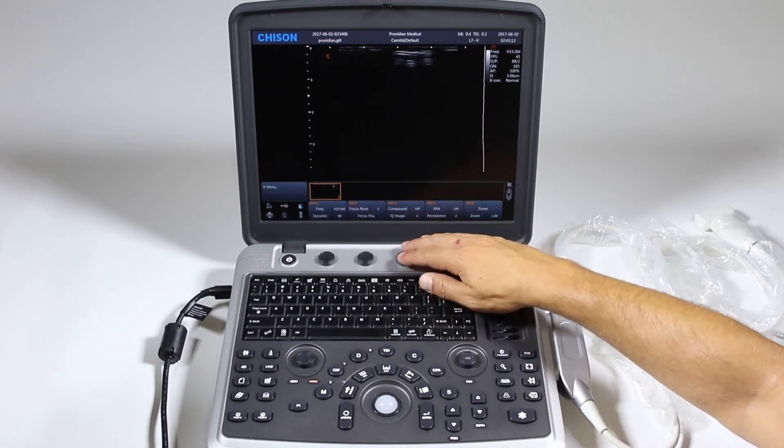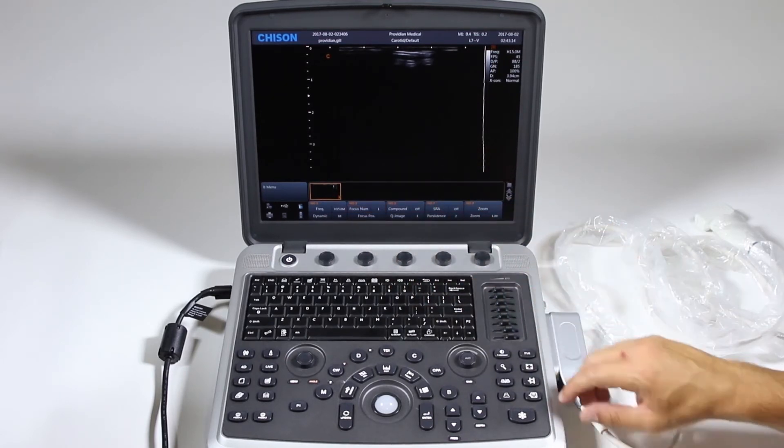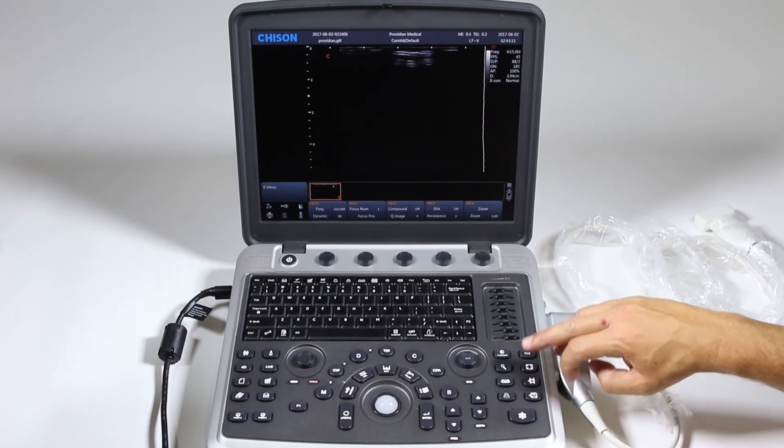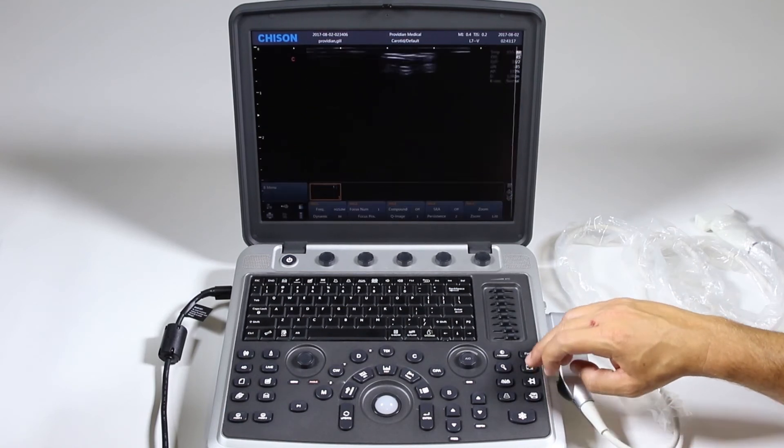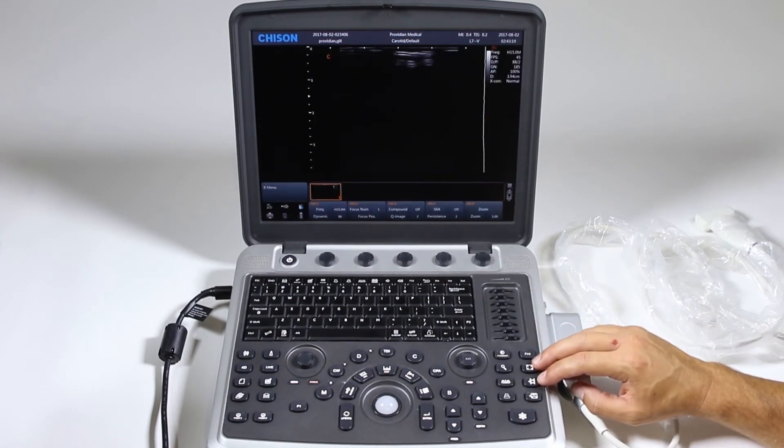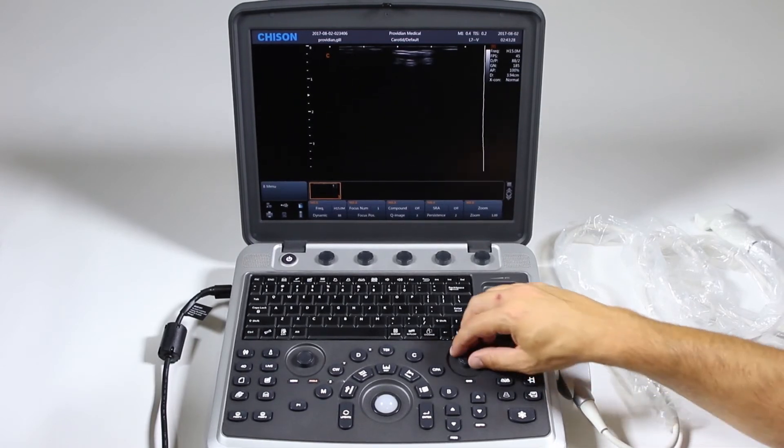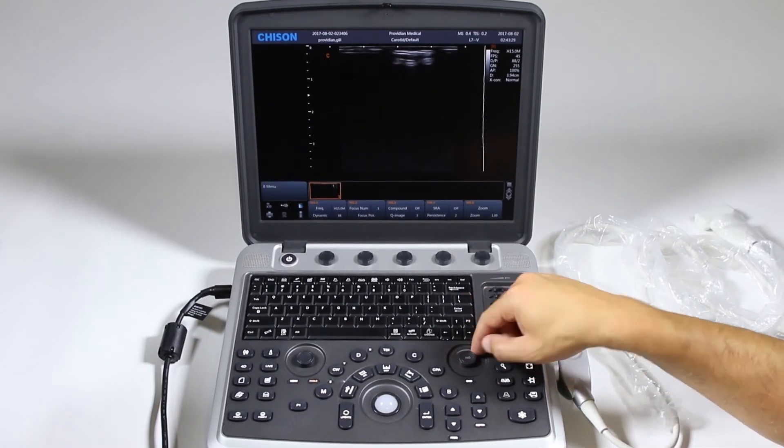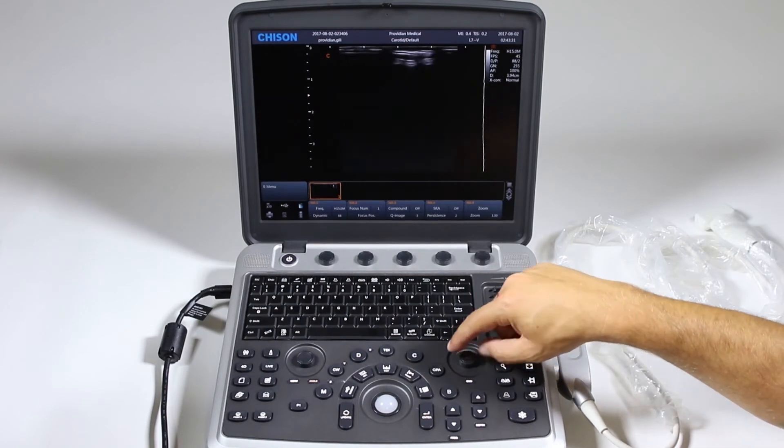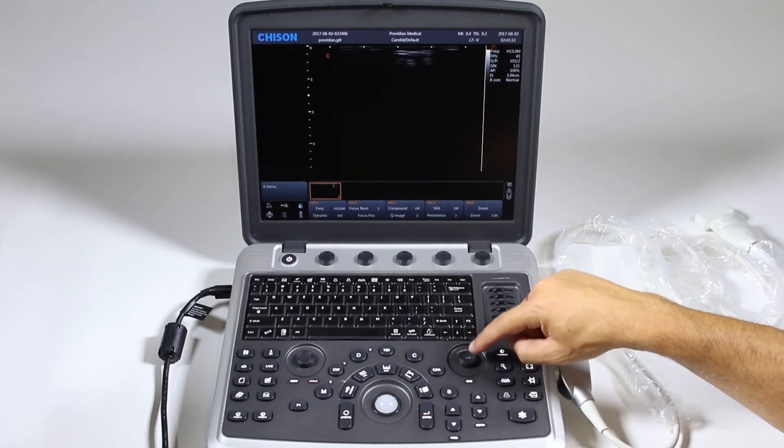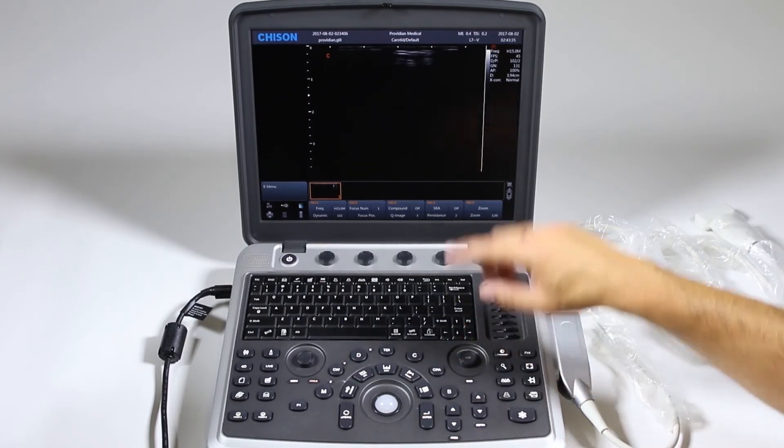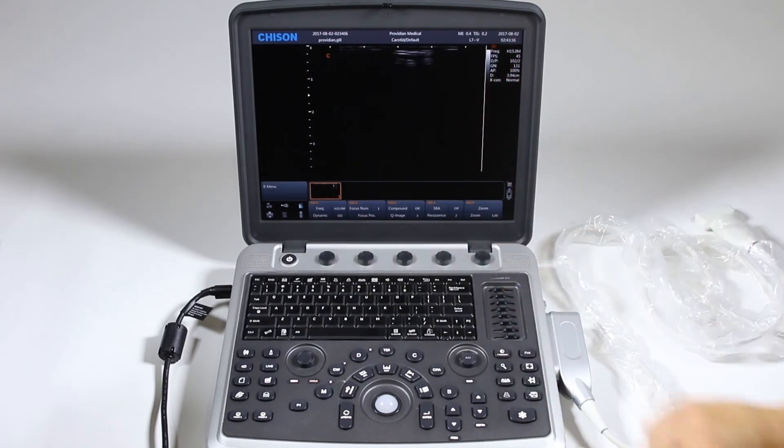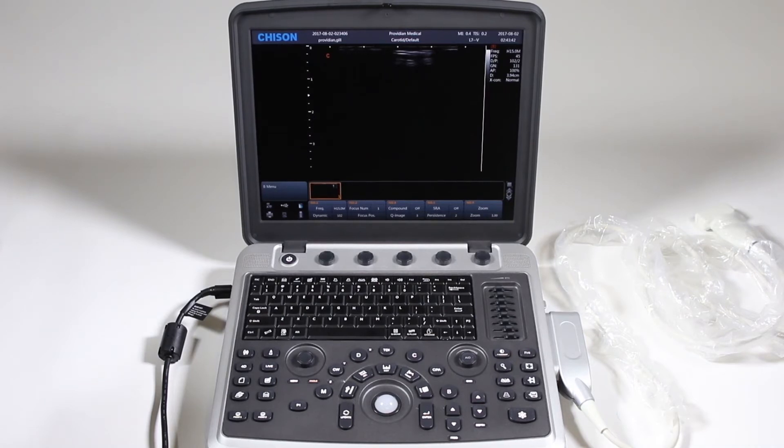Compound imaging also. Again, try all these different ways. If you want to see a larger screen, you can click this to go to full screen view. Click it again to go back to the regular screen view. Your gain control is here. Just twist it to change the gain. If you want to try its automatic image optimization, it's actually pretty good on this machine. It will try and look at your image and give you the best image possible as far as the gain is concerned.